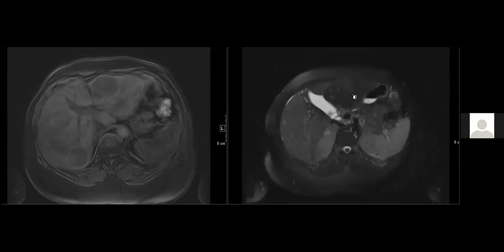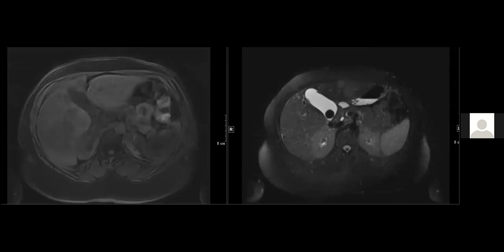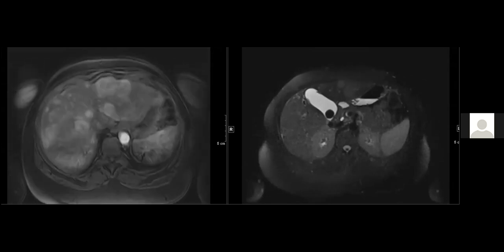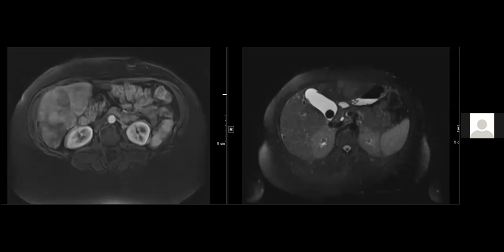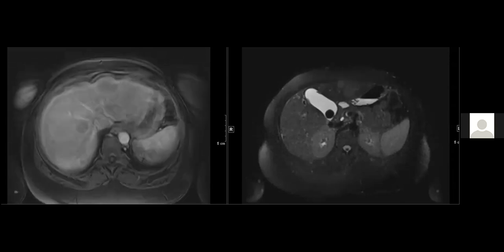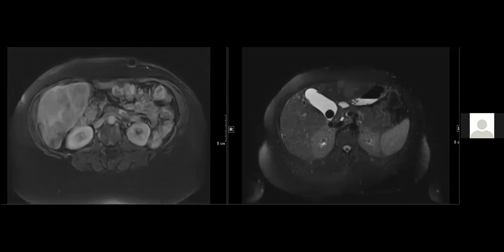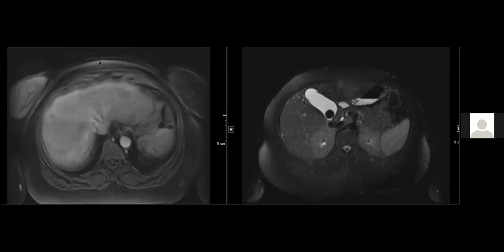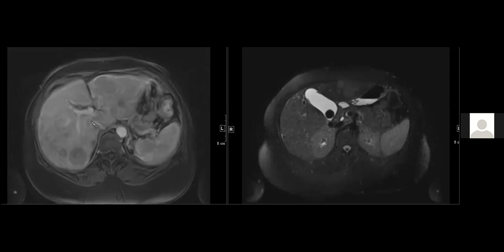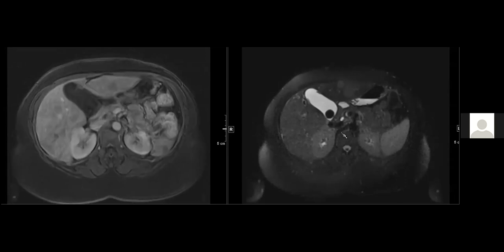And these are the liver masses. As part of the workup, the patient had an MRI. And you can see the entire liver is studded with the masses. Again, no cirrhosis, and her AFP is completely normal. All the tumor markers are normal. And aside from chronic hep C, she has no prior history.